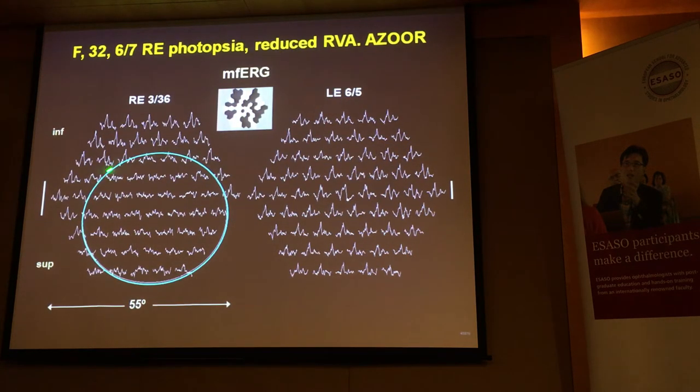Multifocal shows you the true extent of the disease. And if you remember looking at the fundus and looking at the fluorescein, the ICG, most of what we were looking at appeared to be functioning reasonably well. Not at all, all completely lost.